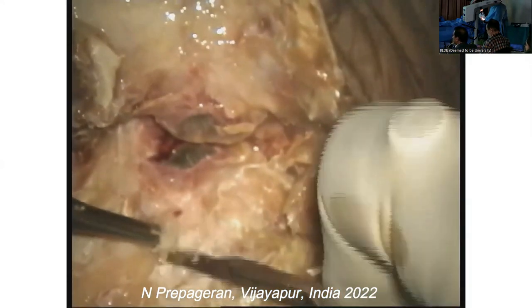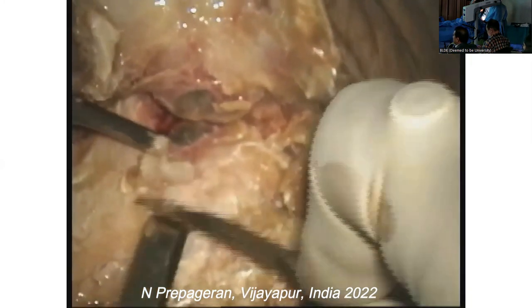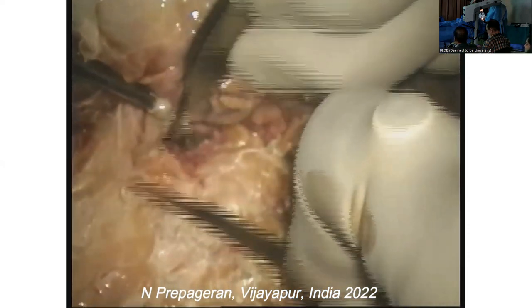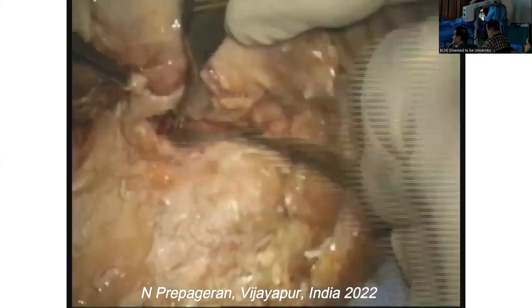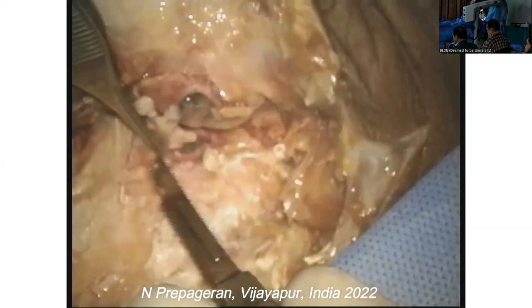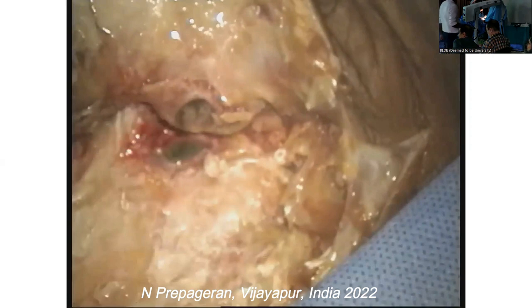Let's remove all this bone, all the soft tissue, then up to the zygoma.